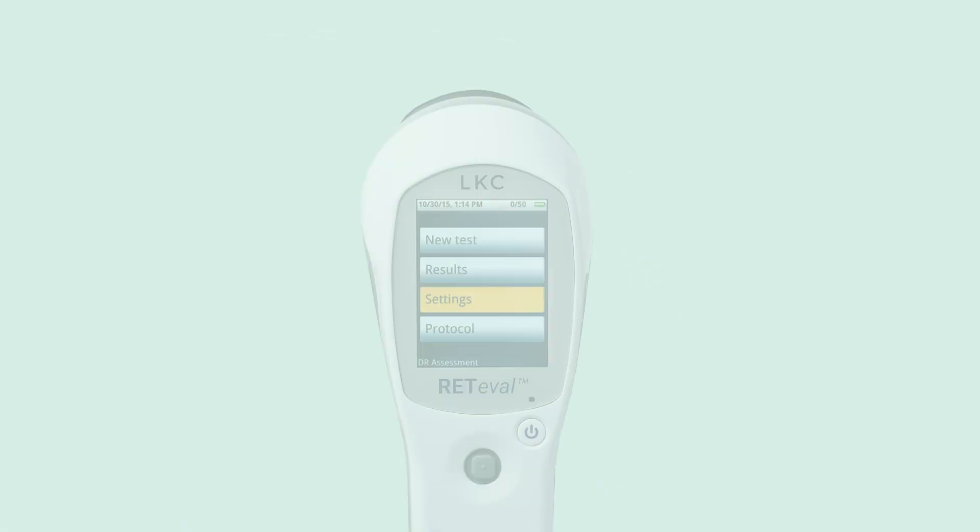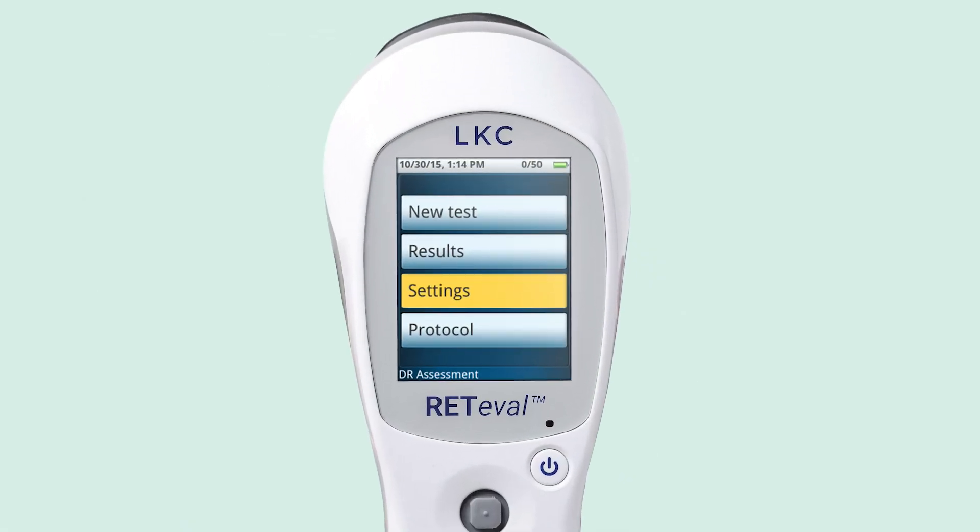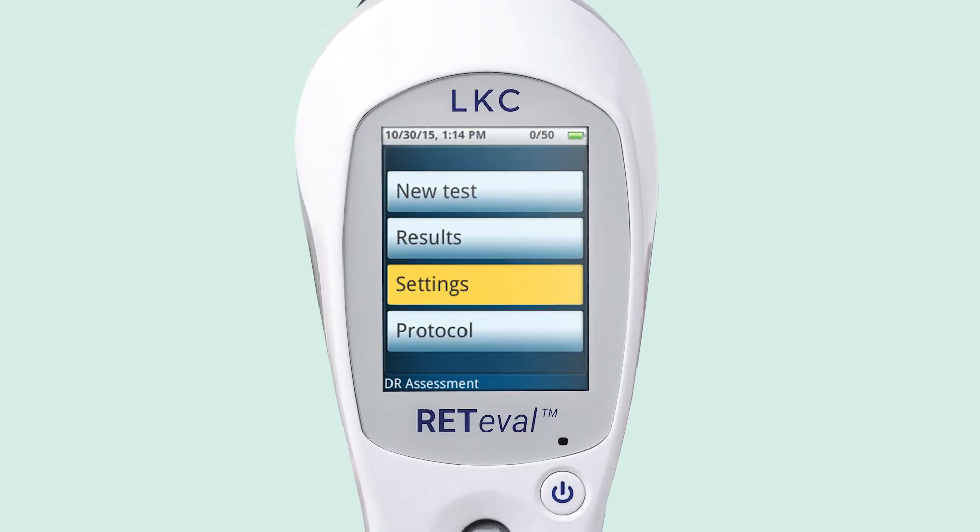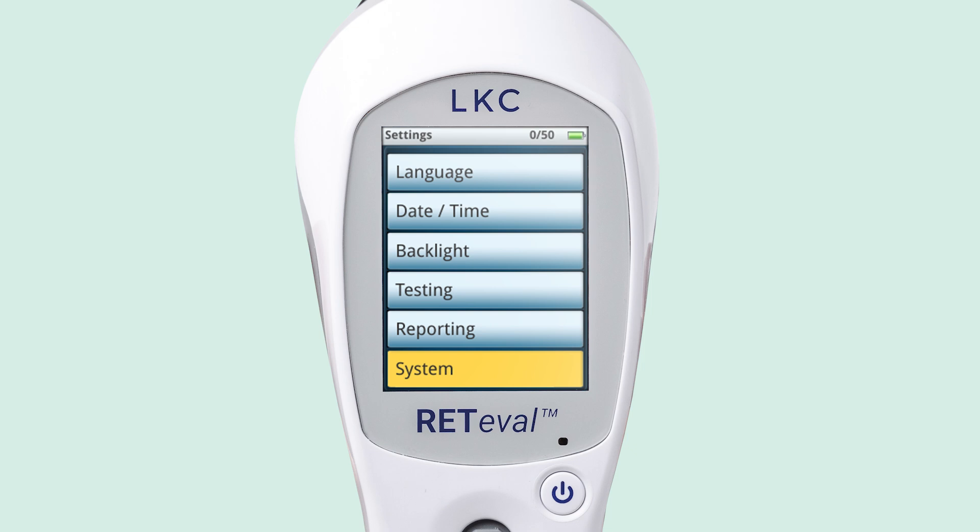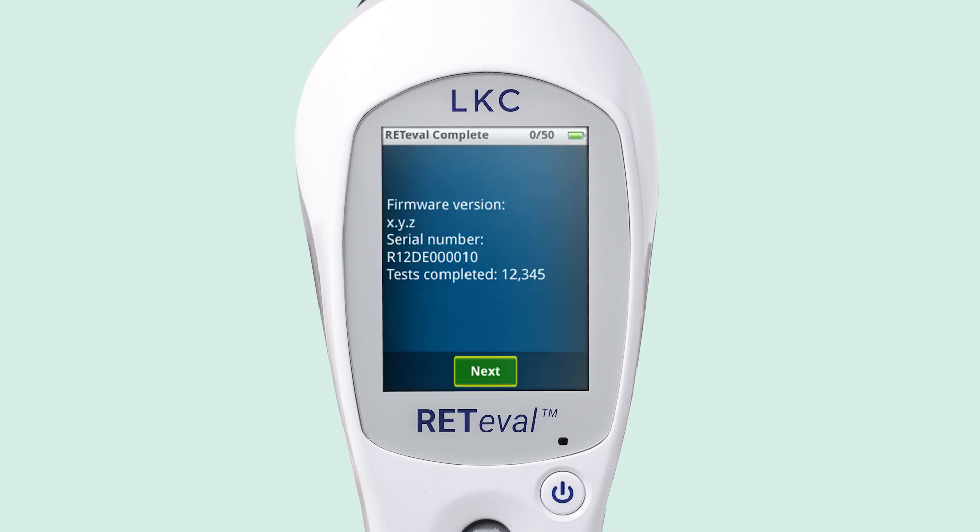To verify that your firmware has been updated, navigate to settings, choose system, and then about. Make sure the firmware version matches the number in the email you received.